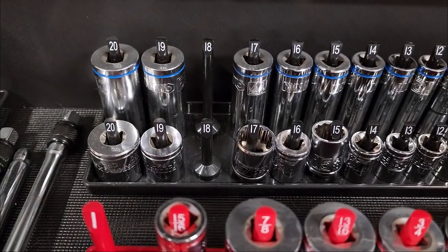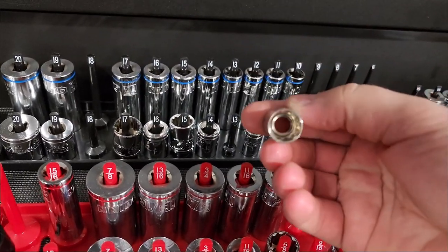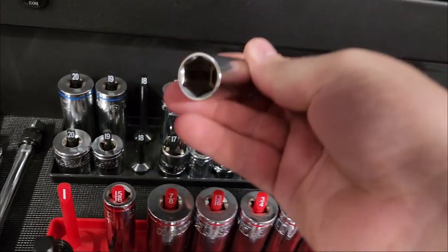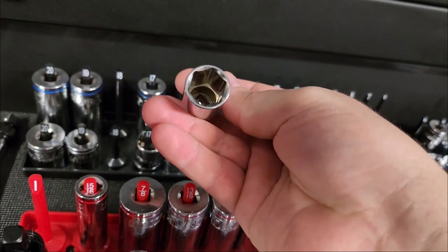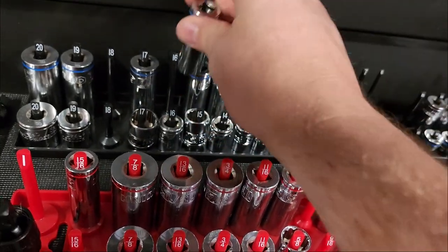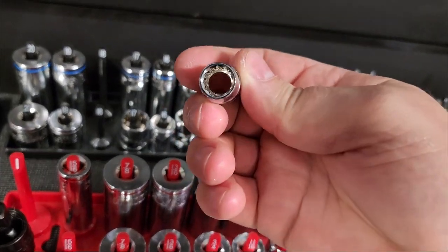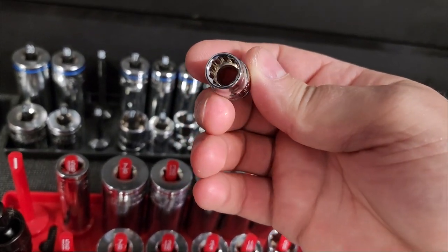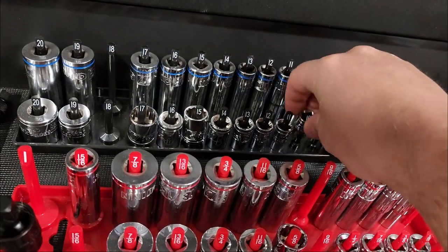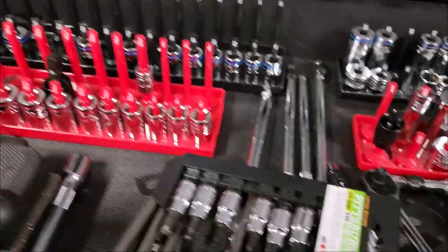Standard sizes are fractional and metric are in millimeters. There are 12-point sockets and 6-point sockets — the points refer to the number of vertices. Six-point sockets are much stronger than 12-point because they have more gripping surface, gripping the fastener at the flats rather than just the corners. That said, 12-point sockets can be more versatile.